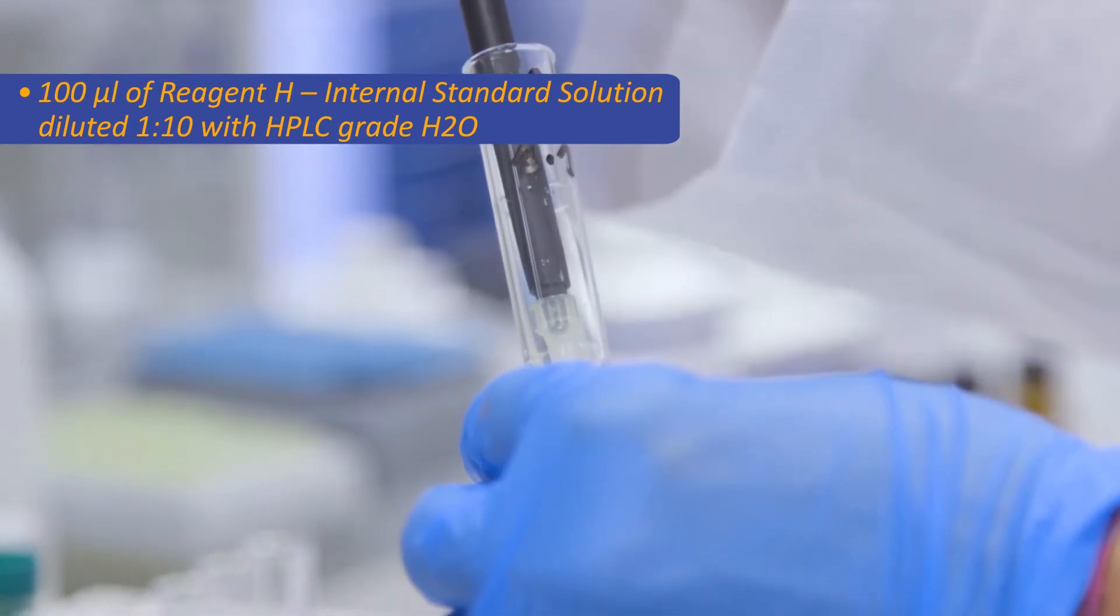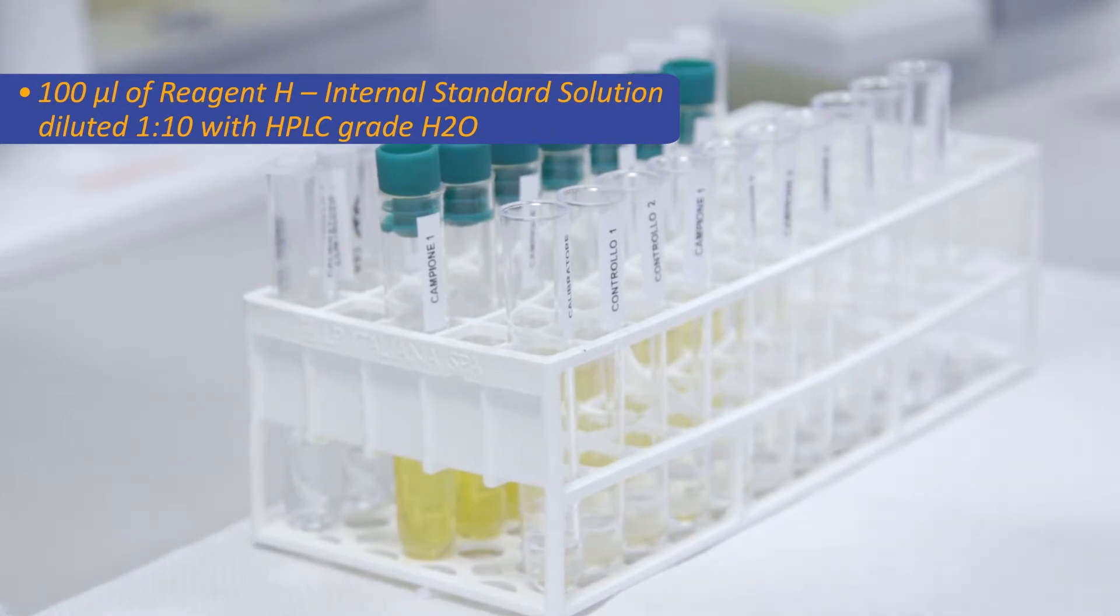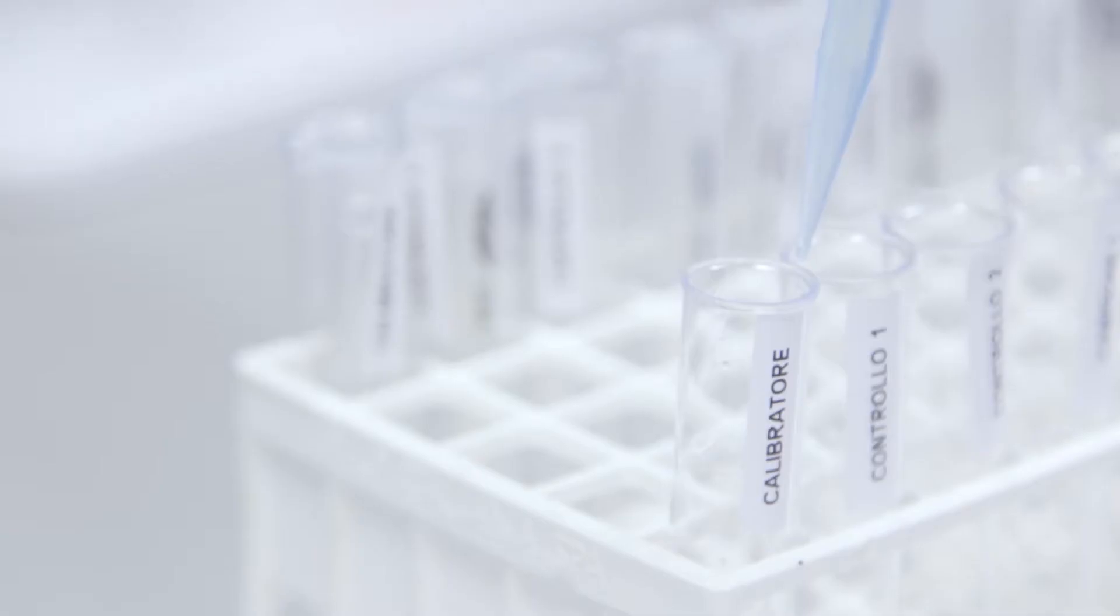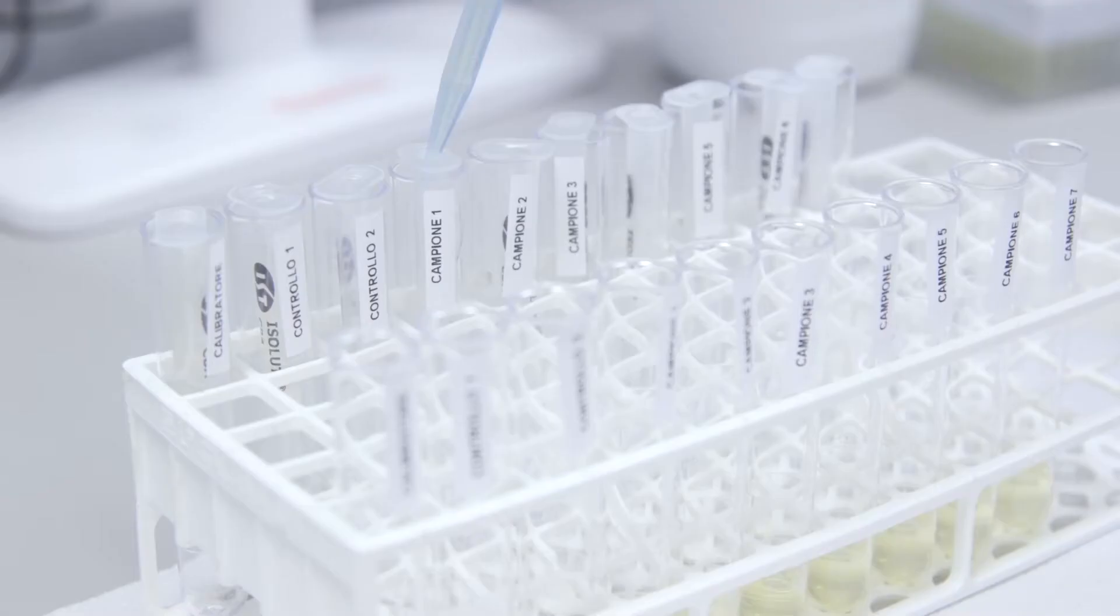We add 100 microliters of internal standard solution diluted 1 in 10 with HPLC grade H2O. Now we add to the already conditioned SPE column 1 milliliter of calibrator sample and control prepared in the previous step.